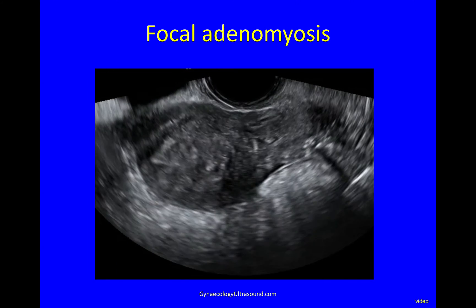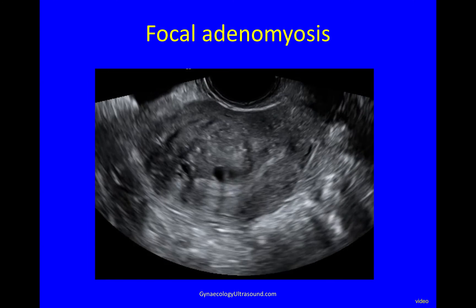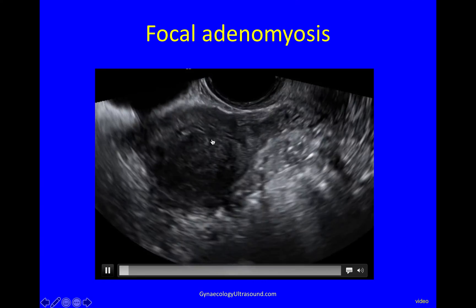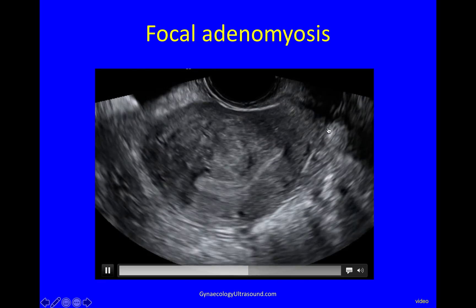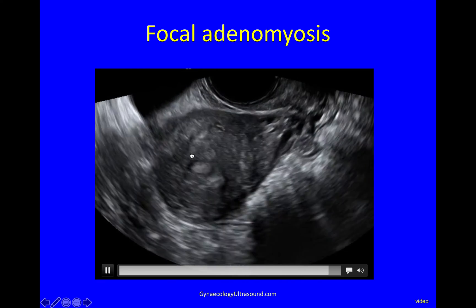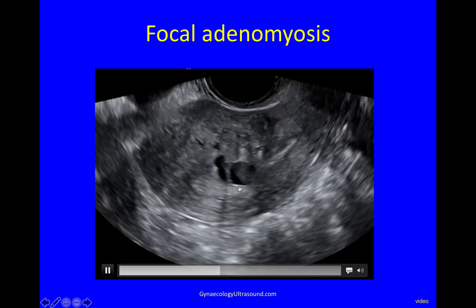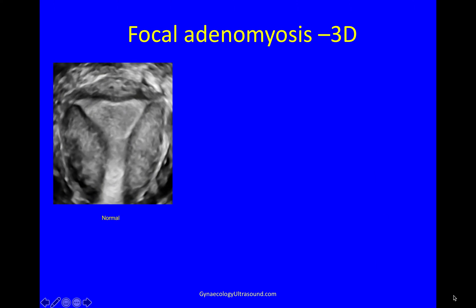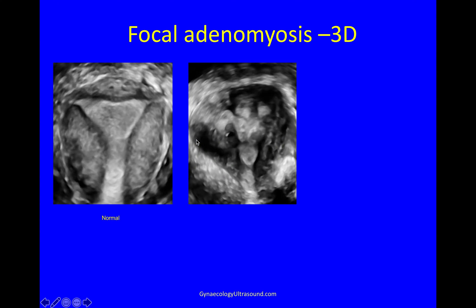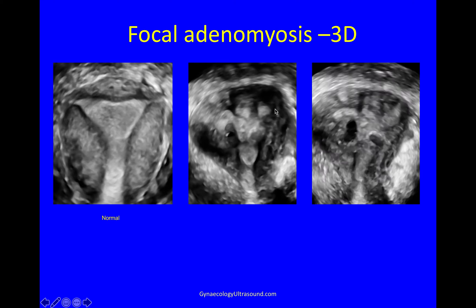3D is very useful for adenomyosis. Here this patient has adenomyosis in the anterior myometrium — you can see the endometrial cavity with islands of ectopic endometrium and areas of hemorrhage within them. If it is less clear, this is what a normal cavity looks like: the endomyometrial junction is this slightly hypoechoic transitional zone. In this case you can see out-budding of endometrium into the myometrium and, in a slightly different plane, areas of hemorrhage indicating focal adenomyosis.